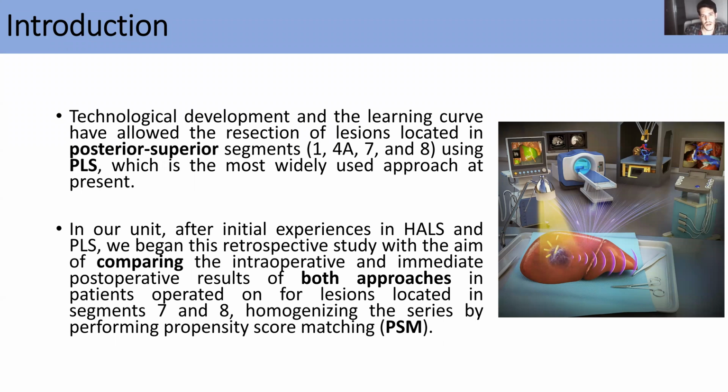Technological development and the learning curve have allowed the resection of lesions located in the posterosuperior segments using a pure laparoscopic approach. In our unit, after the initial experience in HALS and pure laparoscopic surgery, we began this retrospective study with the aim of comparing the intraoperative and immediate postoperative results of both approaches in patients operated on for lesions located in segments 7 and 8. And then we performed a PSM.